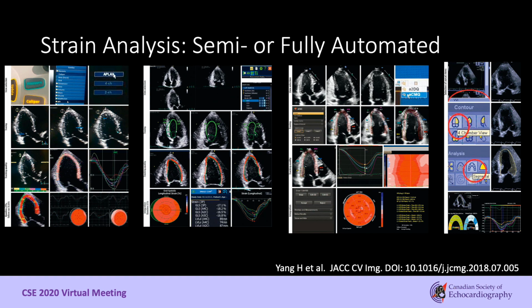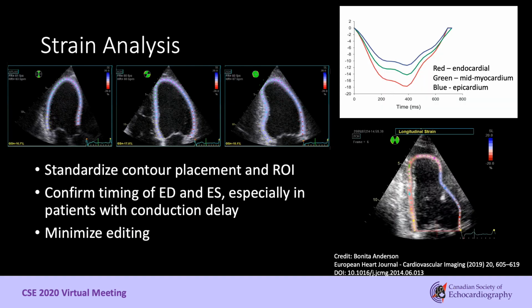Semi and fully automated methods are available for strain analysis. This is a nice paper published in 2018 summarizing, with videos as well as images, the different vendor platforms that are available out there, and I've added this reference in for you.